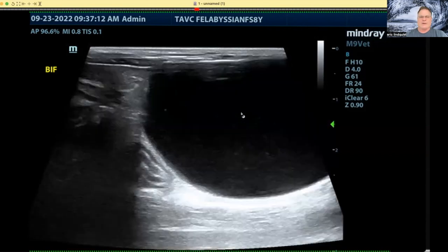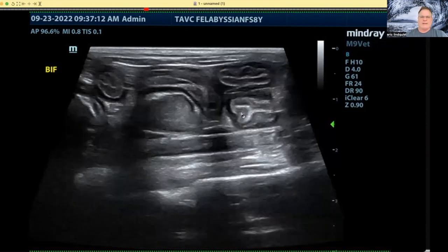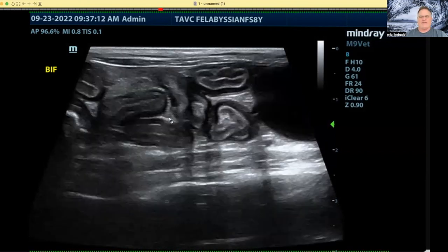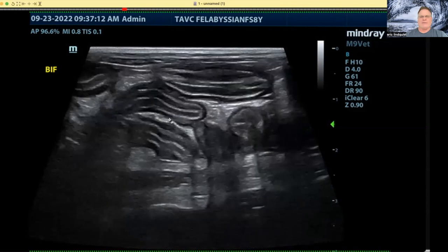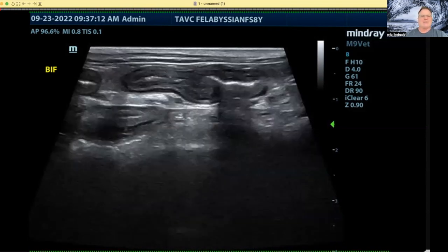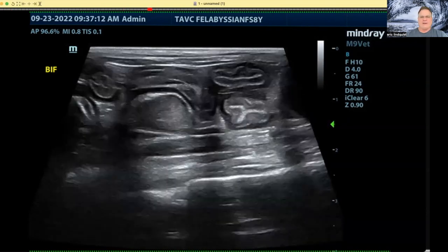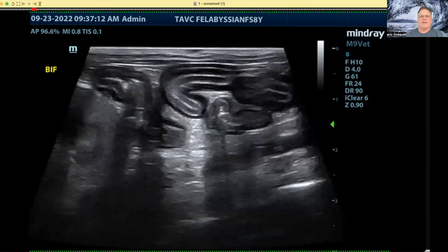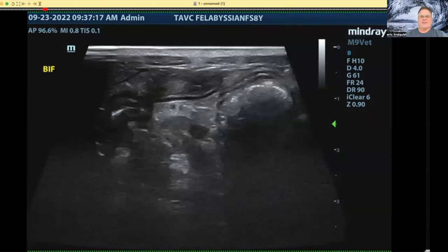Let's see if we have any nodes here. These are typical mesenteric lymph nodes — they're longer than they are wide, and therefore more likely reactive. Obviously histopath, cytology, and special testing are important, but these are the tendencies we see sonographically. This video is nicely catching the mesenteric root and the jejunum and ileum.